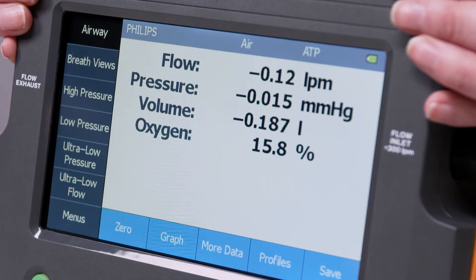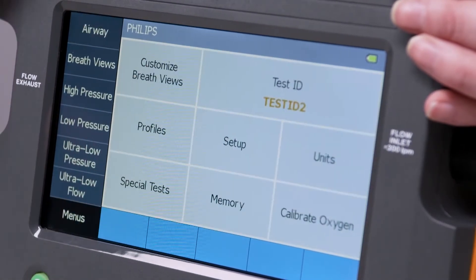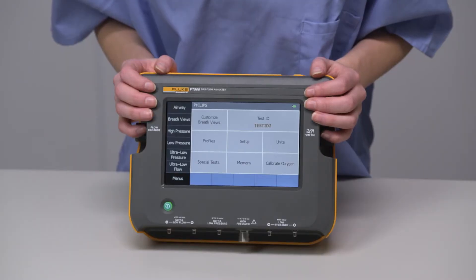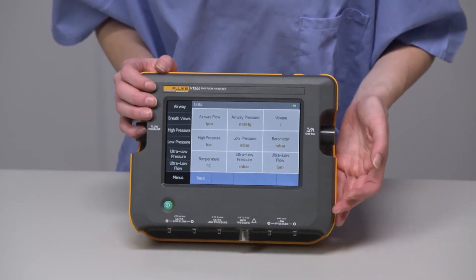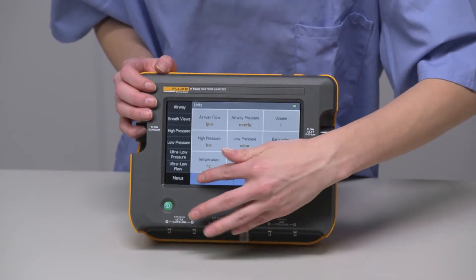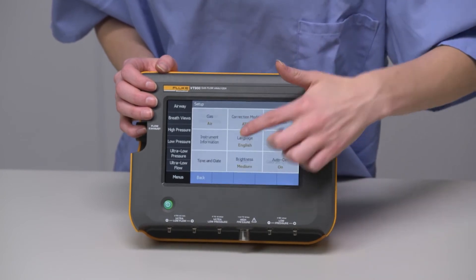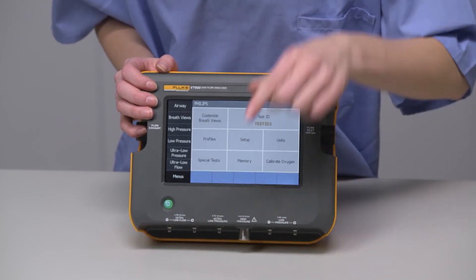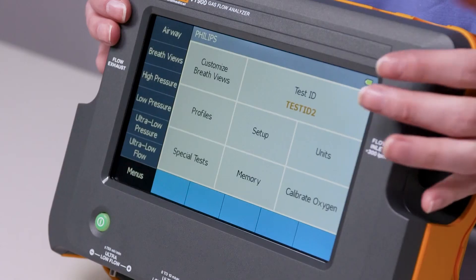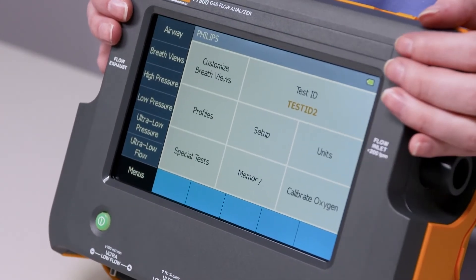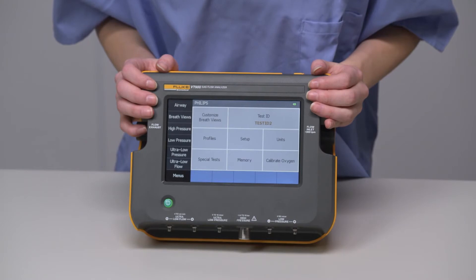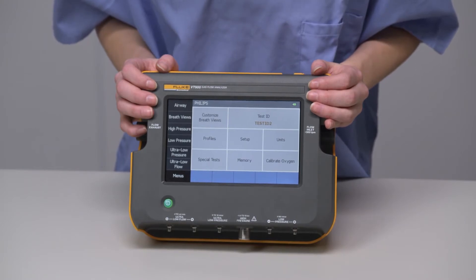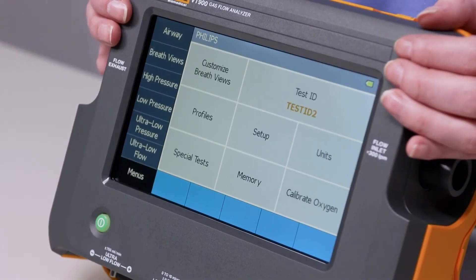Let's go back to the menu. Now we can configure the whole device in this way — units, gas type, correction mode, breath views, or other settings. You can configure to personal preference, or sometimes manufacturer's service manuals have measurements in a specific unit, and it's helpful not to have to do manual conversion.